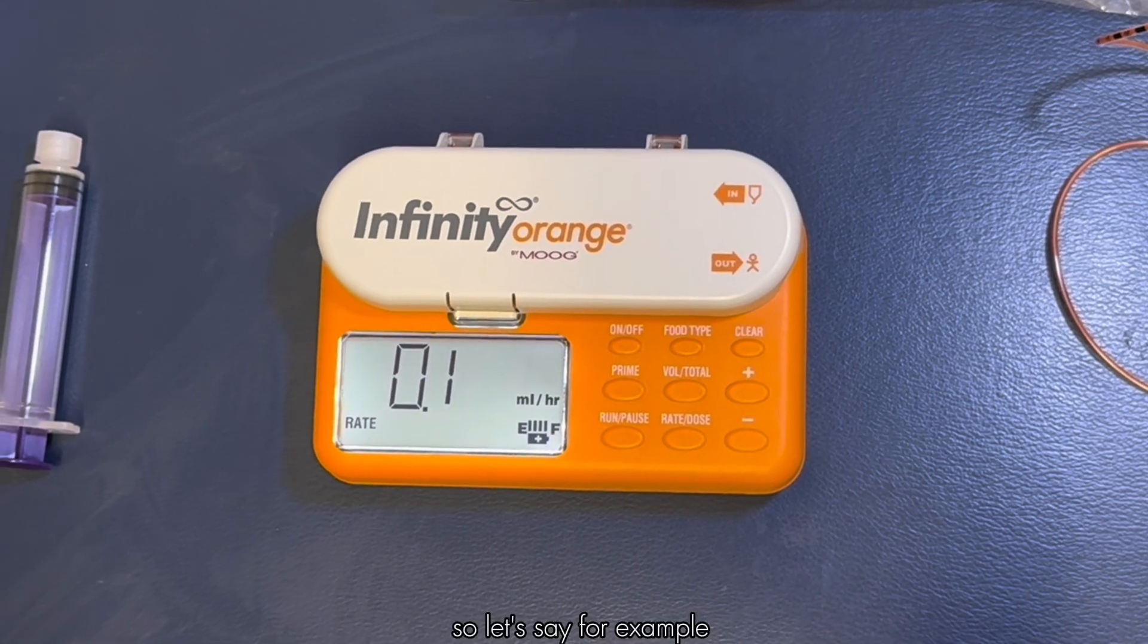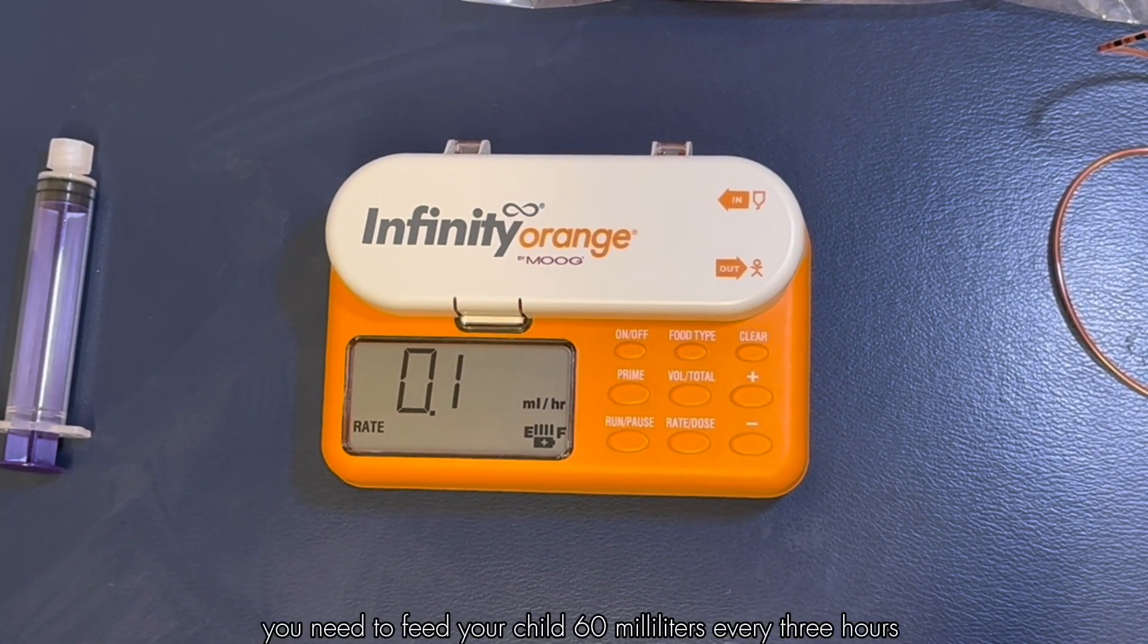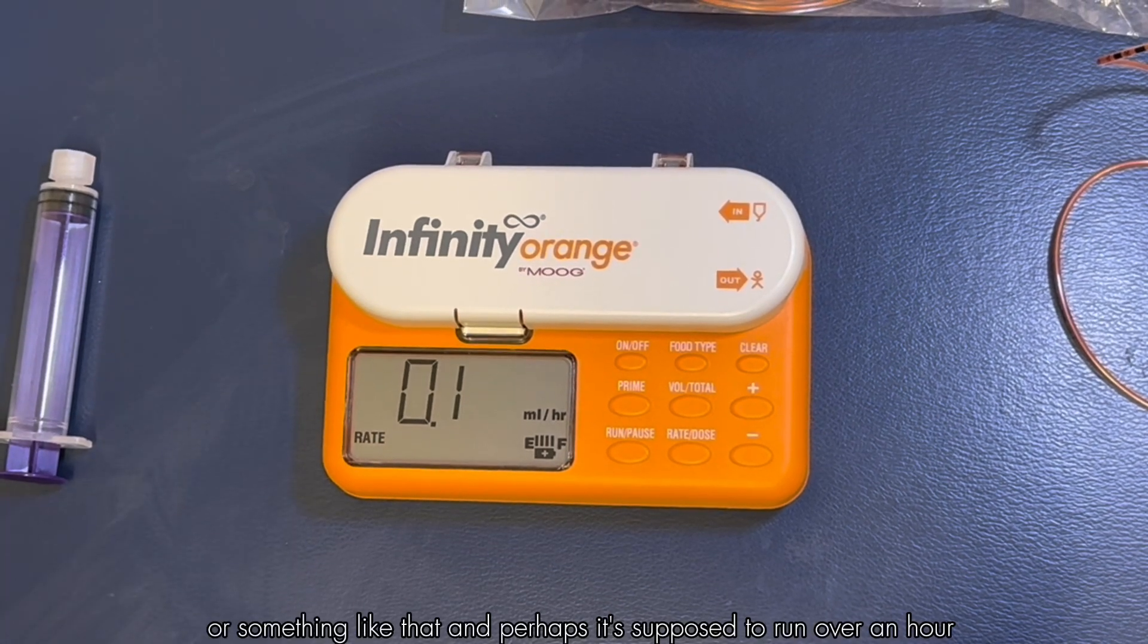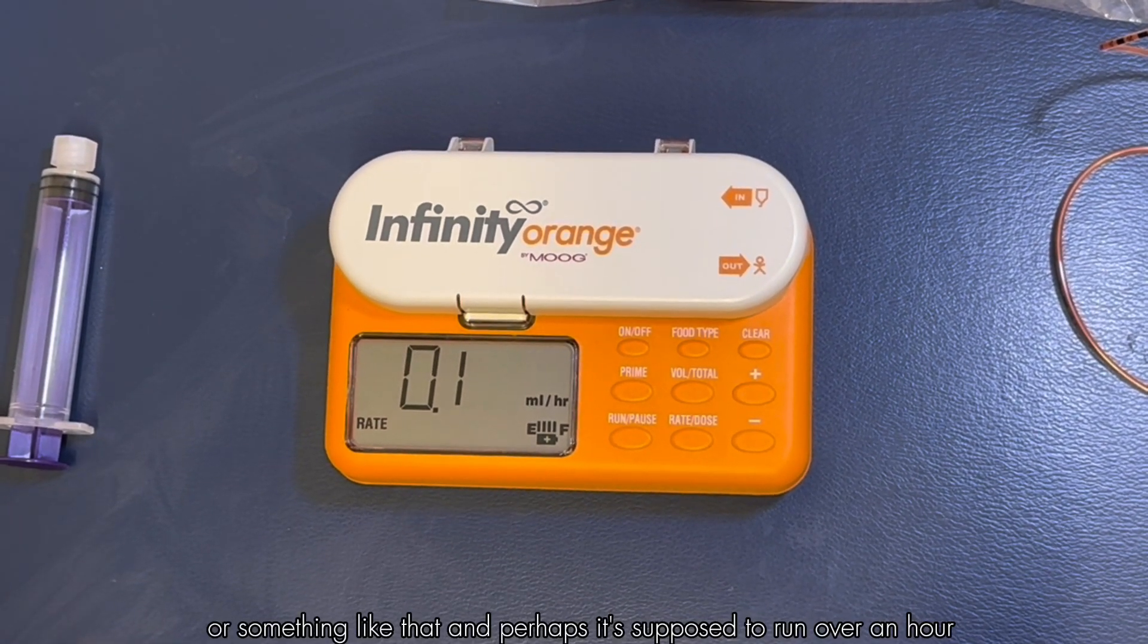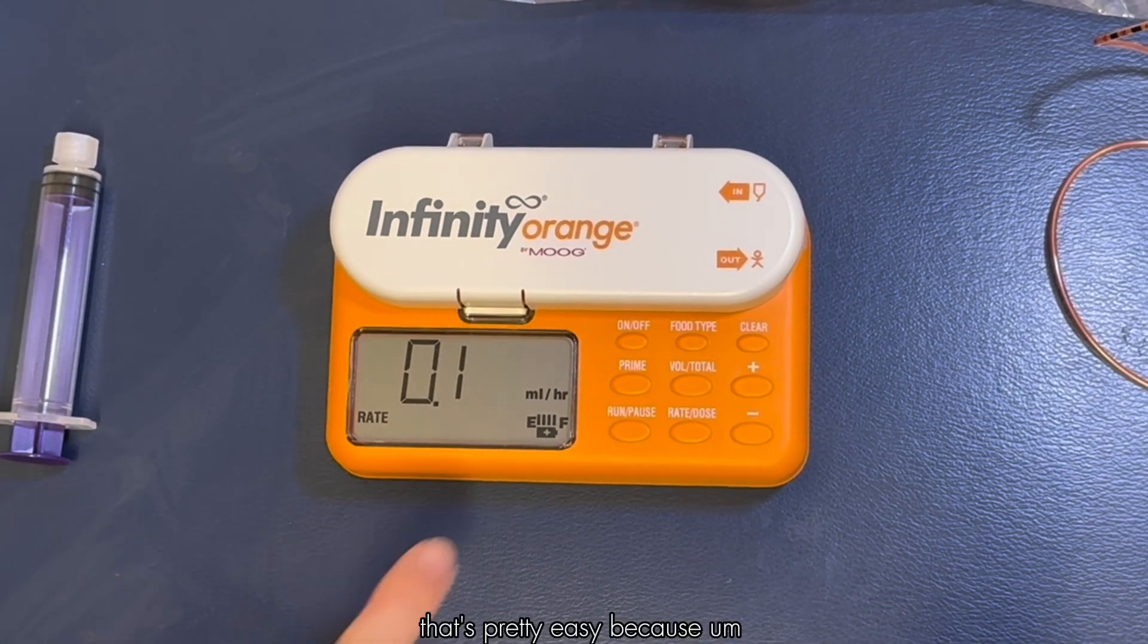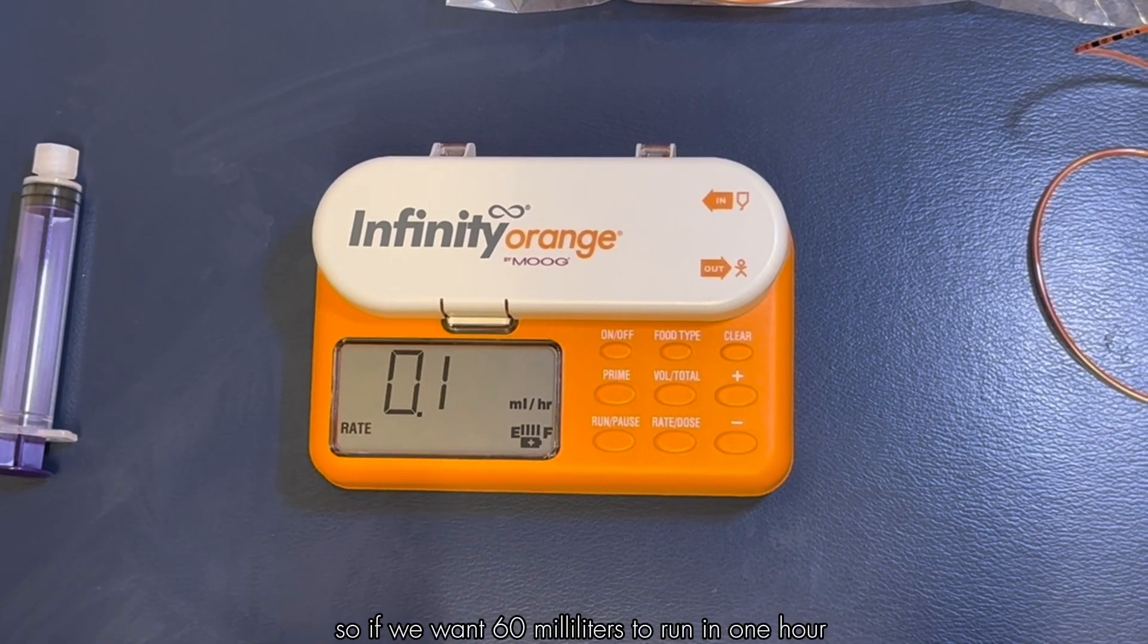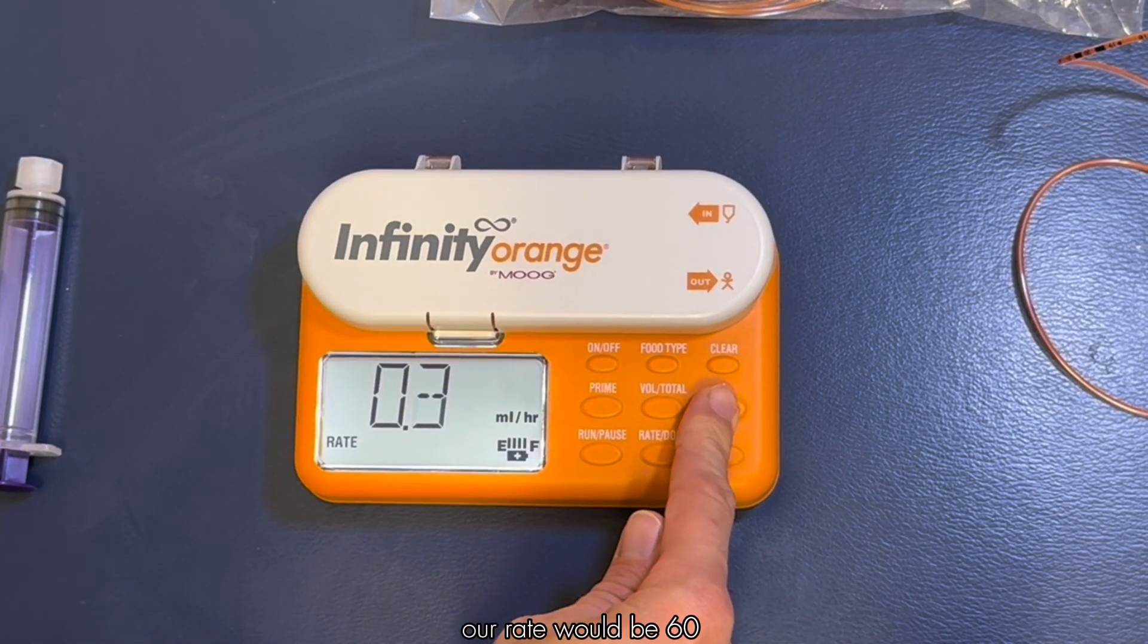Let's say for example you need to feed your child 60 milliliters every three hours and perhaps it's supposed to run over an hour. That's pretty easy because the rate is in milliliters per hour, so if we want 60 milliliters to run in one hour our rate would be 60.